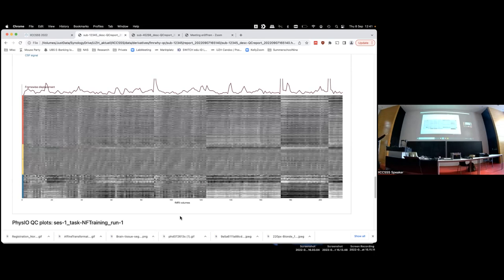This is the frame-wise displacement value. So this is like the distance from the mean of your voxels of the time series and the shift of this voxel given that moment of time where you are. Overall voxels, exactly. Of course, you could do this if you have a specific target region in your brain, let's say the amygdala again. Otherwise you look at rotation and translation, and you normally have 6 parameters. This frame-wise displacement is a combination of all of them. It contains 3 translations and 3 rotations, and is then weighted into 1 value so that you see whether it is a bad value or not.